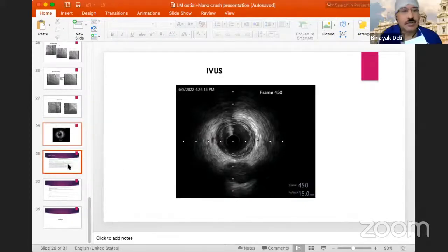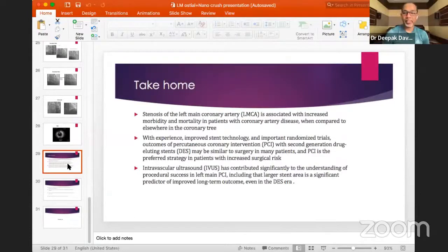Dr. Davidson, any comments? Yes, sir. Dr. Farhana, very meticulously done regarding both the cases. The first one, the most important point that I liked is for the ostial left main, you started off with a Judkins catheter through the femoral approach, a 7 French guide catheter.